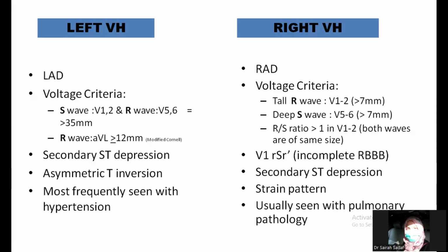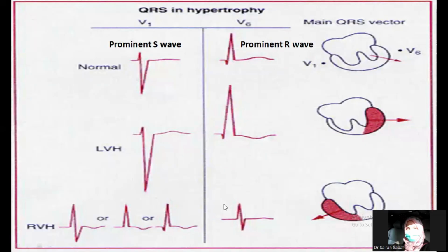So now let me show you some ECGs and you will get the whole picture, for better understanding. Okay. First of all, let me draw the lines here.